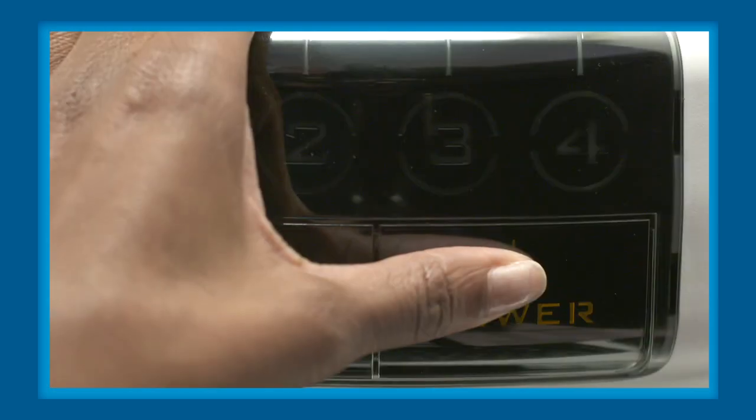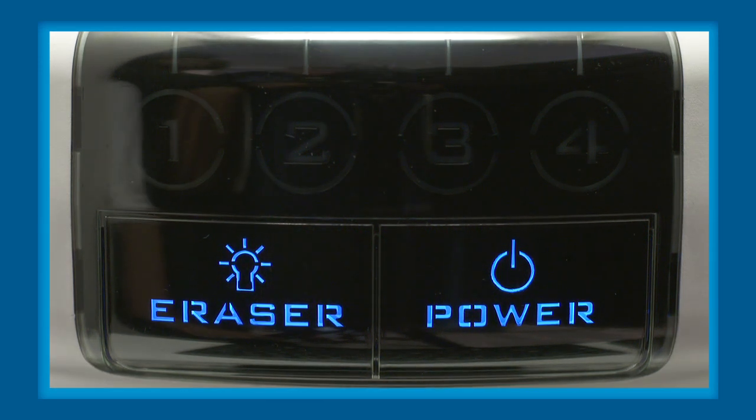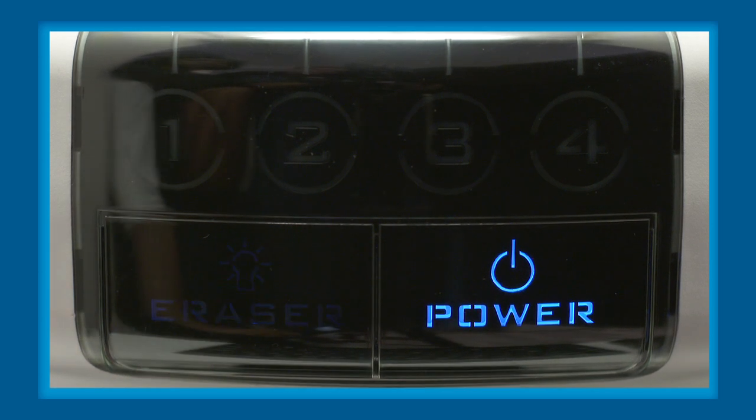Turn ScanX on by pressing the power button located on the front of the unit. You'll also notice the eraser button, which controls the inline eraser function. This is turned on by default so that your flexible sensors are ready to be reused as soon as they have been scanned. You can turn this feature off by pressing the eraser button. A blue LED will keep flashing to indicate the inline eraser function is disabled.